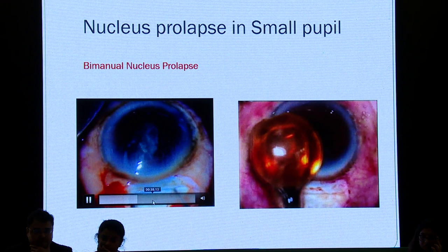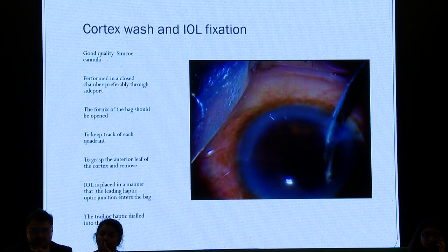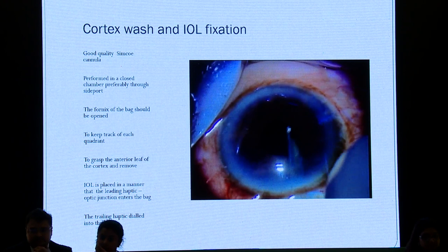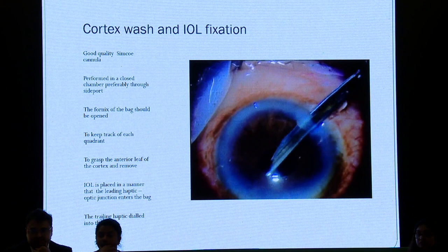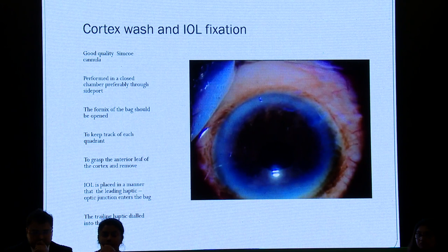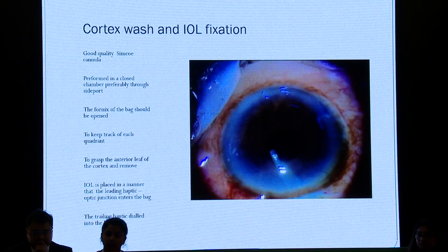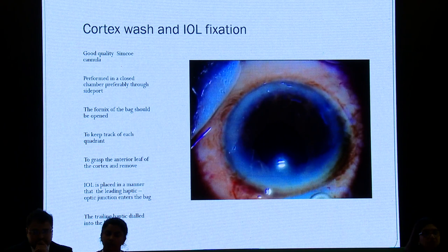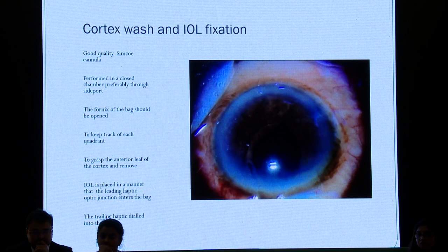Cortex wash and IOL fixation are again tricky. Use a good quality Simco cannula — make sure it's not rusted or split into multiple layers, because once you enter and come out, you may nick the posterior capsule. The view is not very good. Preferably perform in a closed chamber through the side port; try to open the fornices of the bag, keep track of each quadrant you're cleaning, and grasp the anterior leaf of the cortex to remove it. The IOL is placed in the regular manner — the leading haptic goes into the bag and the trailing haptic-optic junction is dialed in. Once you see two-point fixation with a nice band on the posterior capsule, you're confirmed in the bag and don't have to fiddle anymore.